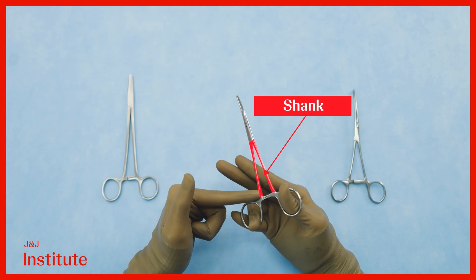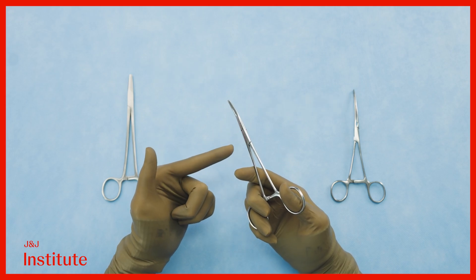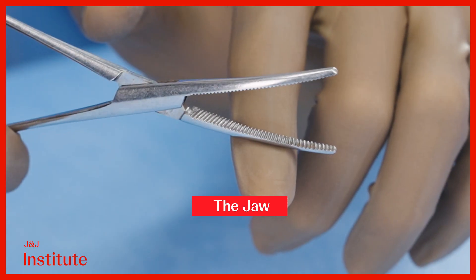A fairly long shank eventually leads to a joint, which is a box joint in this case, or it may be a hinge joint in the case of scissors. The end effector of the instrument is a jaw which ultimately interacts with tissues.